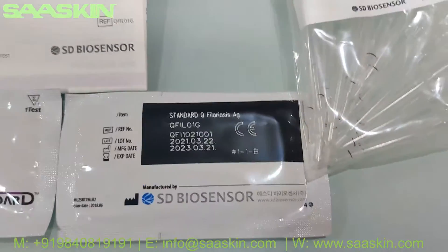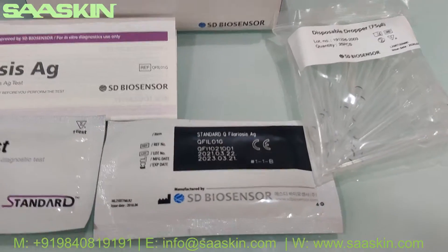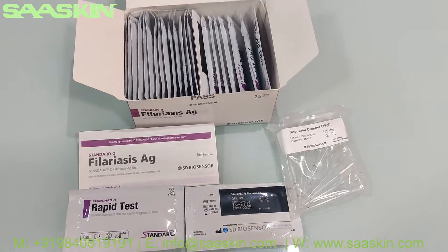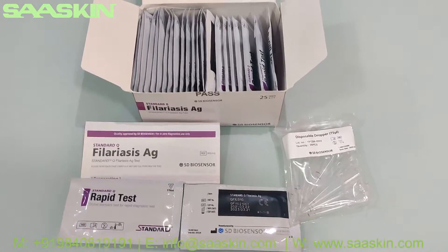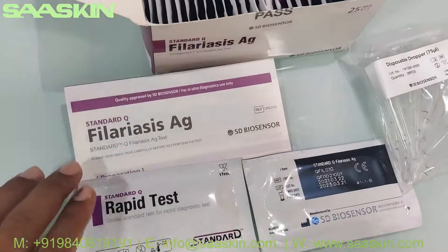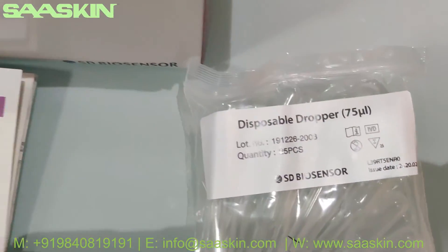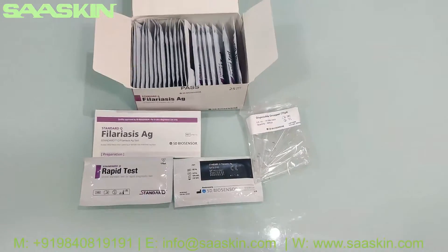You can see the product code and two years of expiry on the cassette. To quickly summarize: the Standard Q Phylaris antigen test kit box contains one instruction manual with a complete guide for preparation, testing, and interpretation of results, 25 pieces of disposable dropper, and 25 test cassettes. This is how the test kit looks like.